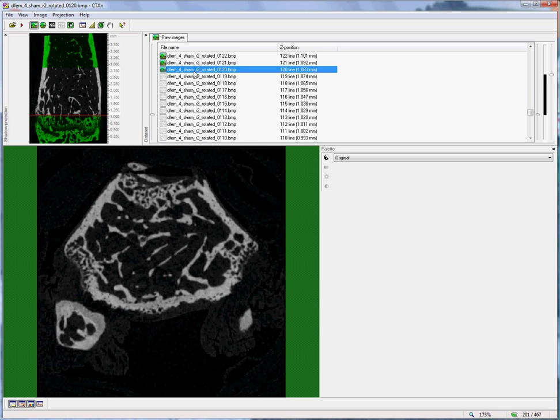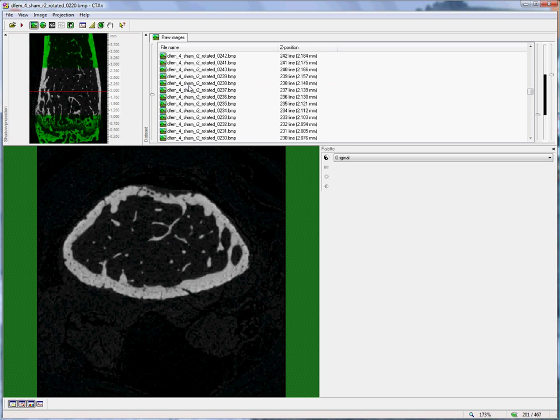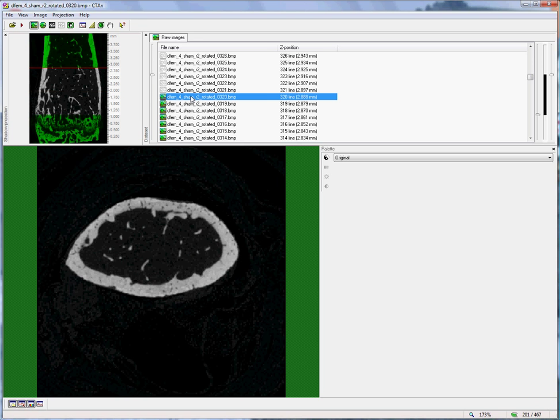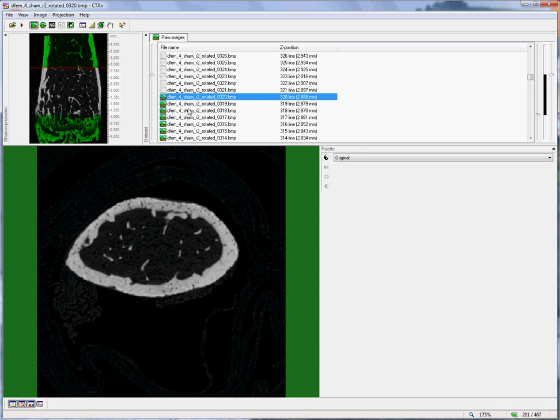And then the trabecular region extends a further 200 slices up from there, from 120 through 220 up to 320, where it then stops. I could have gone further, but this region probably includes the majority of the metaphyseal trabecular bone. So this establishes our vertical range of slices relative to the growth plate, the first step in the analysis.